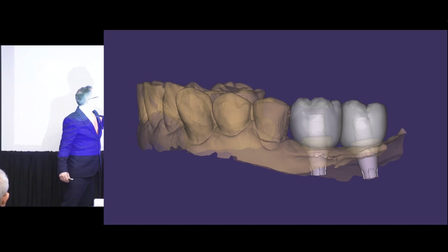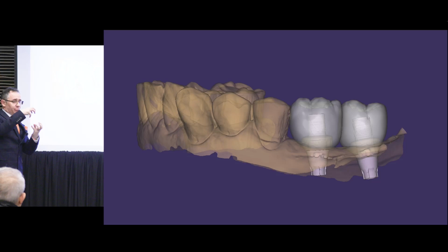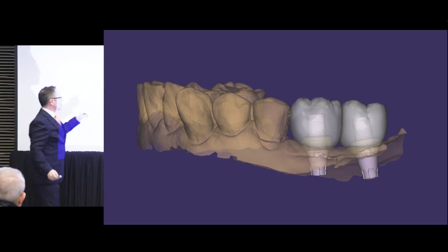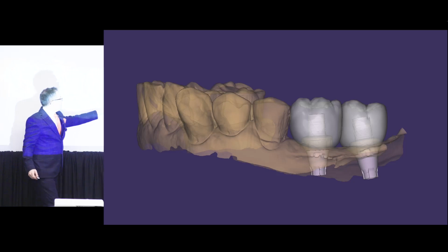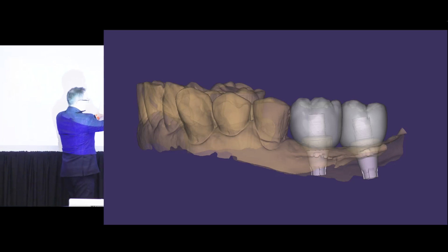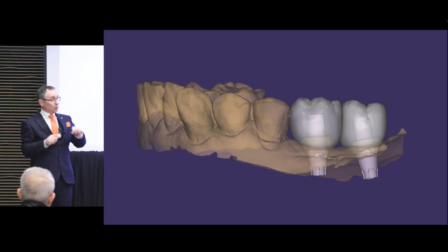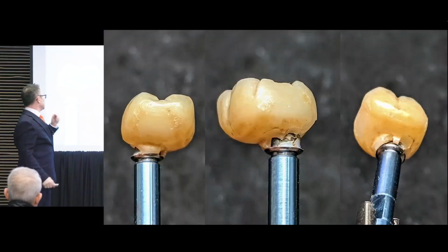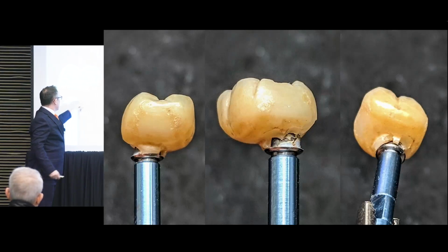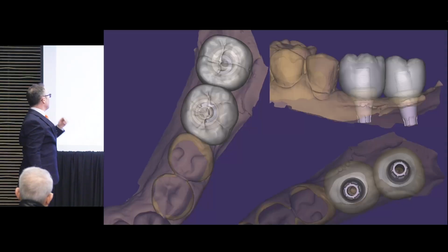And what can I do? I can instantly look at it and think, okay, I've actually got a really good retaining body to crown ratio here. I'm already happy. What else did we do? I'm going to avoid them being thin at the neck because we've got the height to get away from where I'm worried about bone. I'm just going to come out as fat as possible, as soon as possible, just below the tissue level. So I'm going to avoid that because I'm not having to do this anymore. I'm going to come straight out because we have the right options for it.